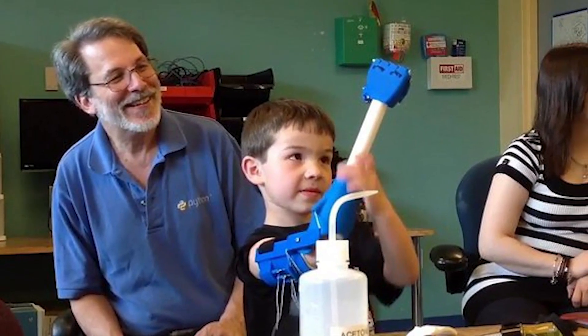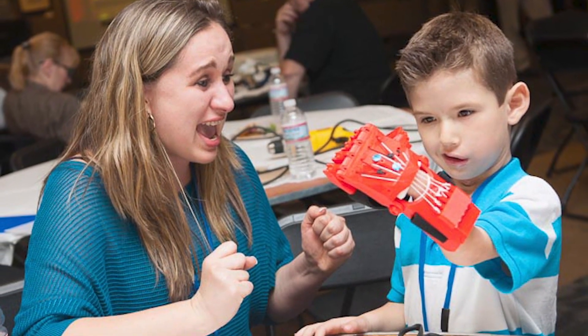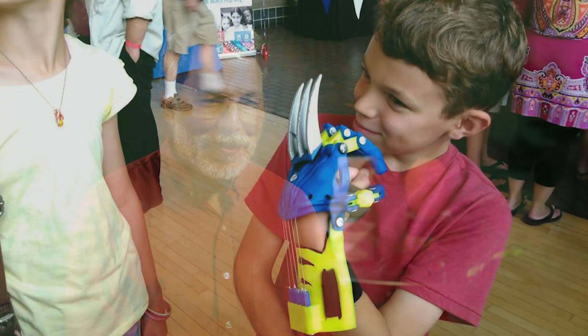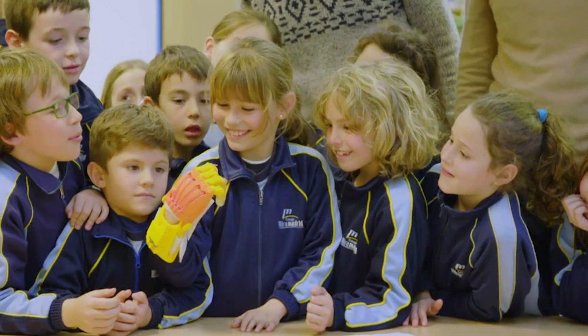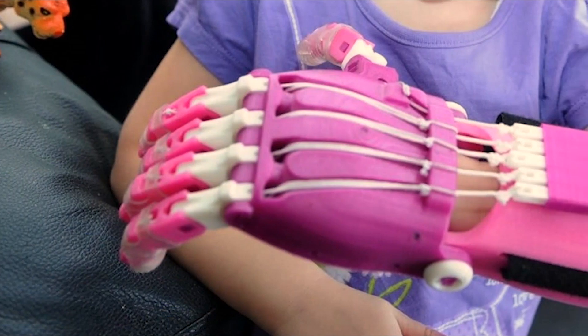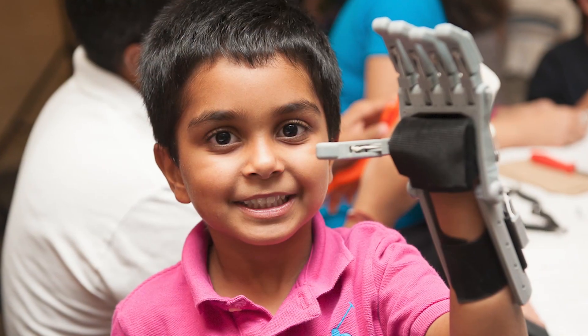We found that the social and emotional impacts of our devices are at least as important as the functional impacts of the devices. We got quite lucky in that the kids look at these plastic hands and they say, 'I got a superhero hand,' and the other kids in the class think that that's the coolest thing going. And so it really changes the interaction between the recipient and their classmates.